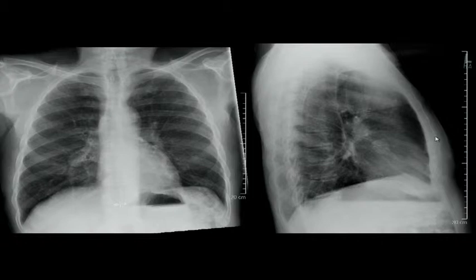All right, John. From the lab of chest radiographs. Opacity in the right perihilar region. Right here. Where, okay. So that is infrahilar region. Yeah. Well circumscribed, has good borders.